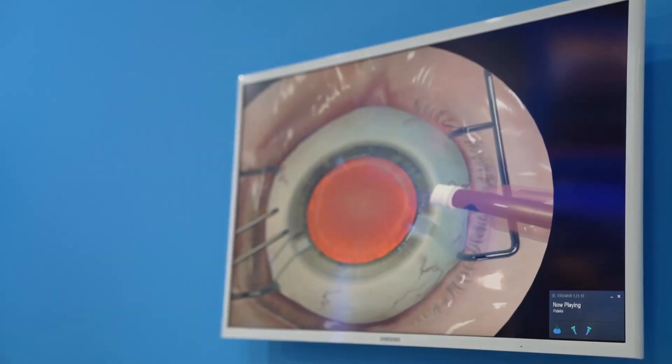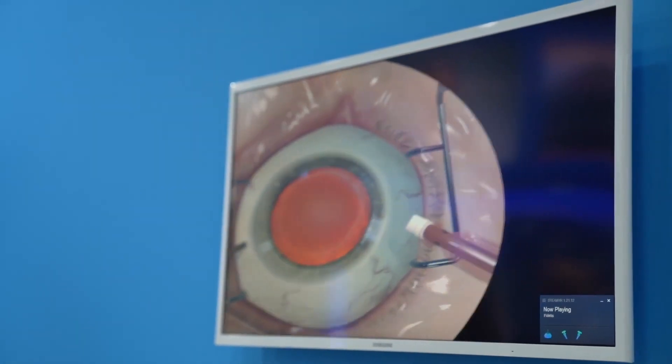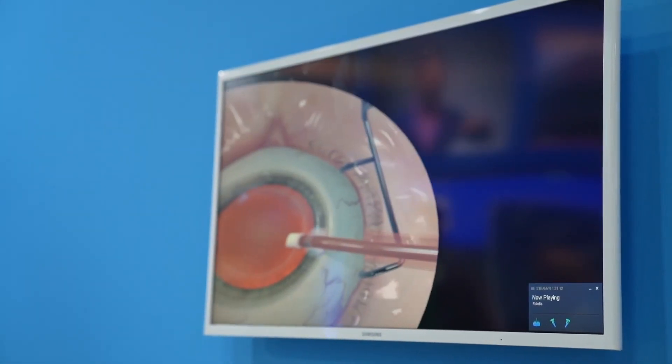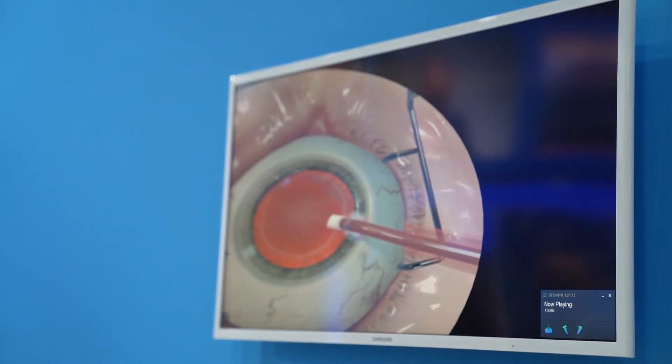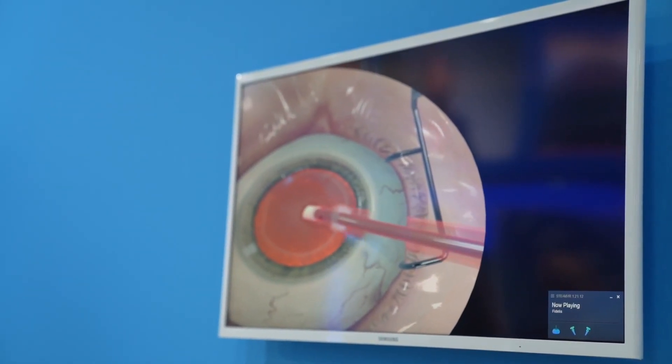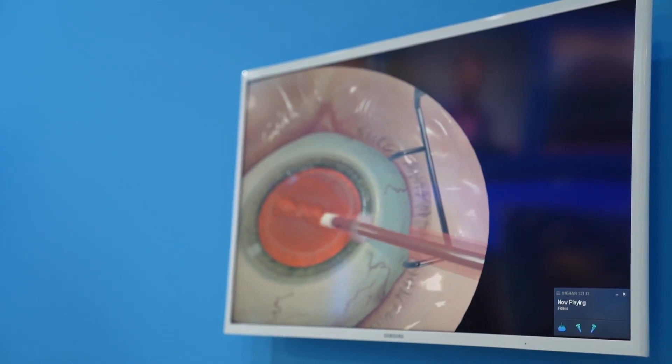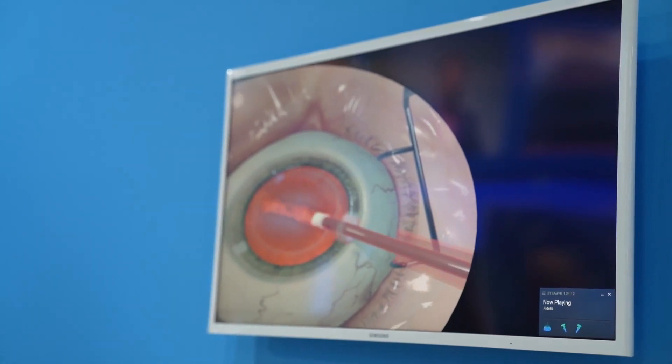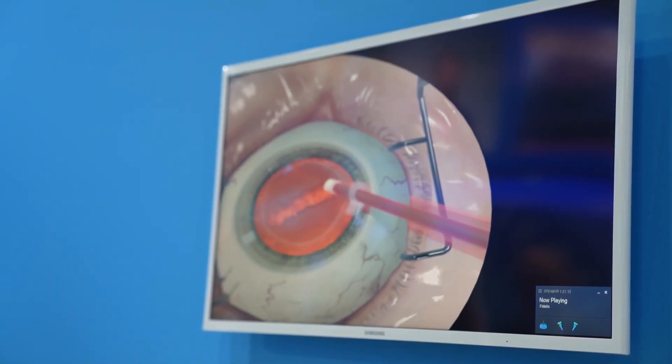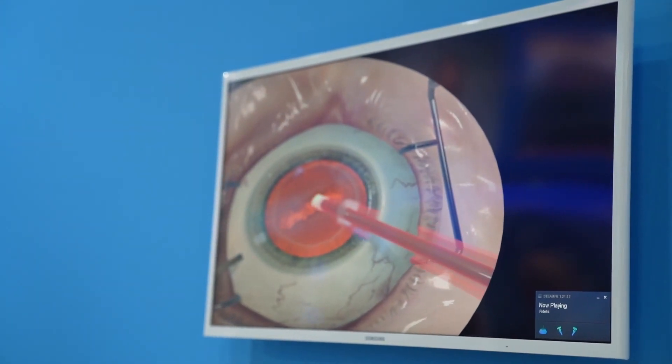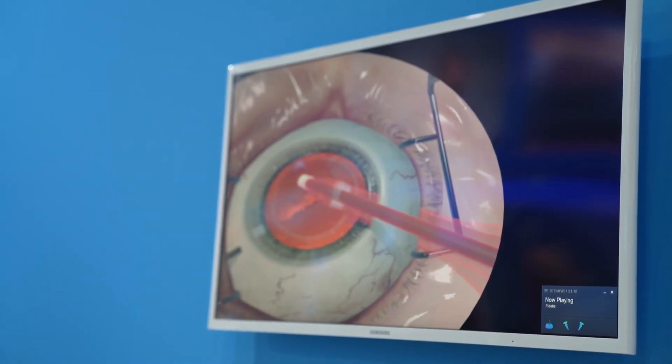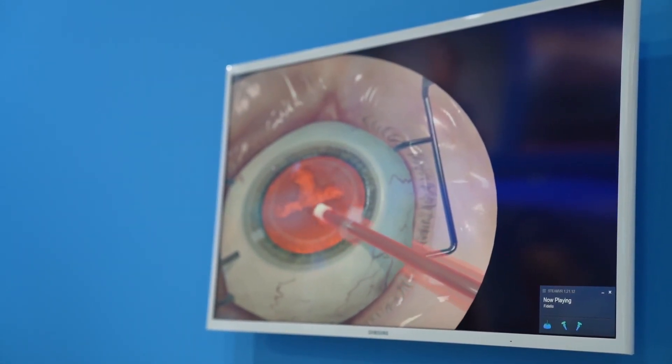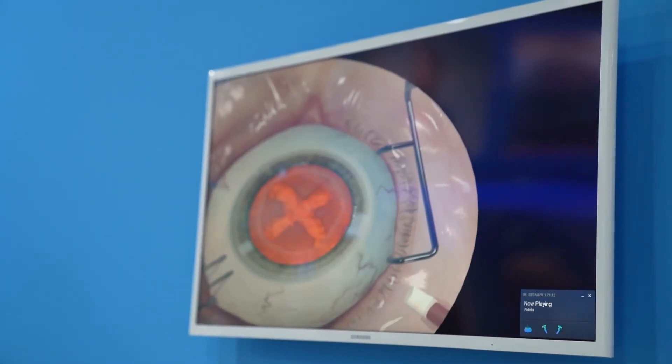We'll now do FACO. Stabilize the eye, insert the hand instrument. Using the integrated Centurion foot switch on the ground, we can groove and, using ultrasound, break up the cataract. I can rotate the lens, stabilize the eye.